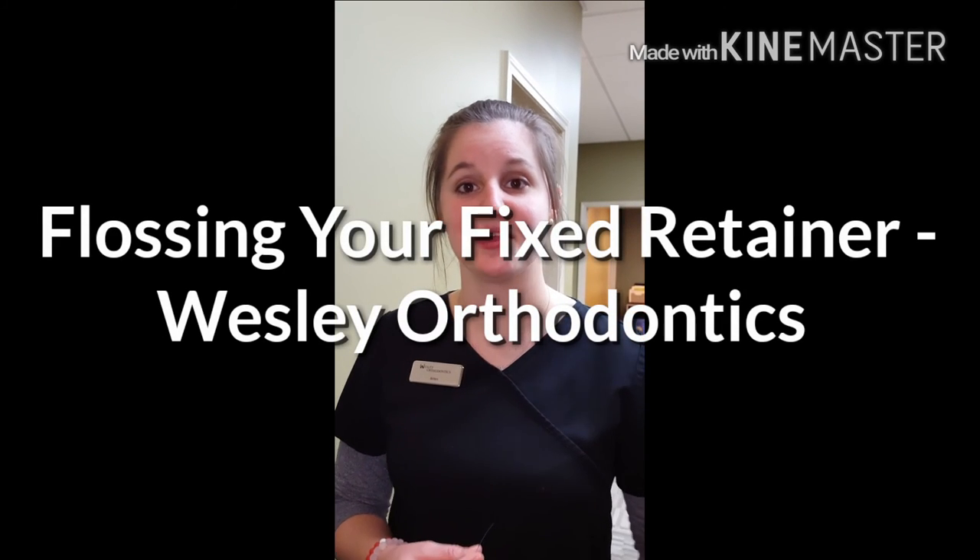Hi and welcome to the Wesley Orthodontics YouTube page. My name is Brittany. I am one of Dr. Wesley's chair side assistants and today I'm going to show you how to floss your fixed retainer. I have fixed retainers on my upper and lower arch, but they're by Dr. Wesley, so I make the perfect candidate to show you how to do this.